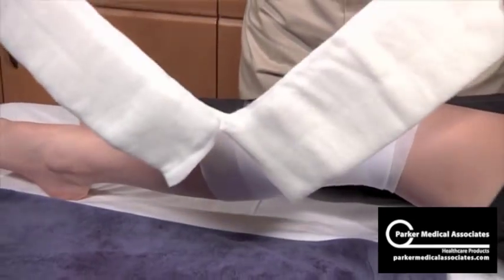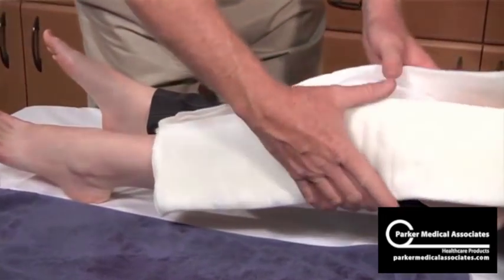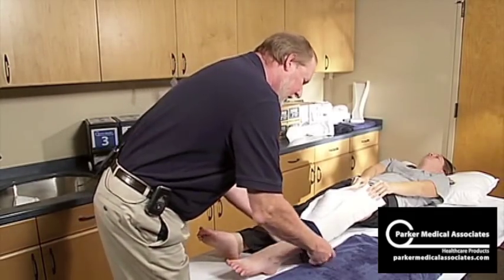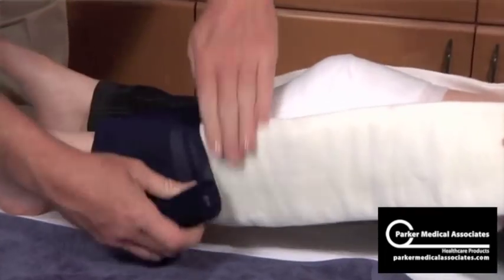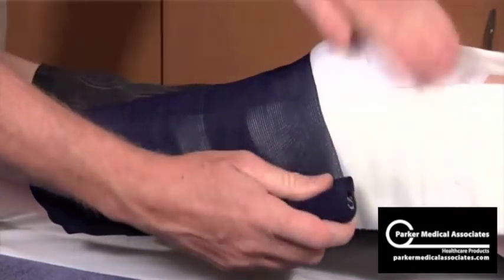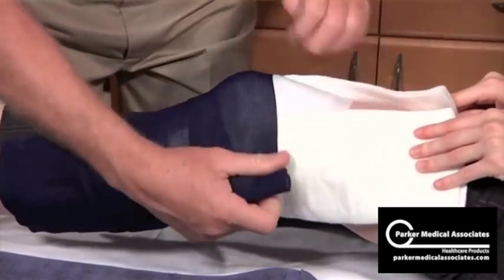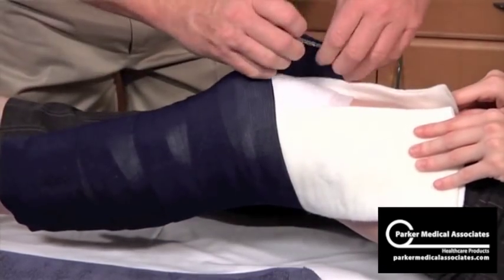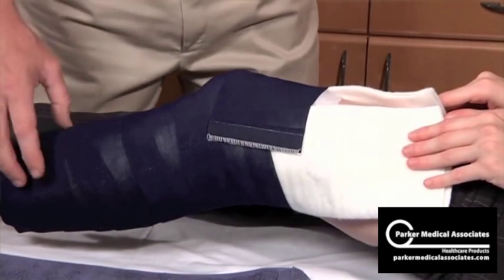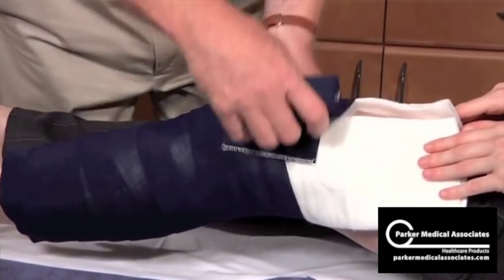Then this tab that you just created — place that on top of the patient's leg anteriorly, and come up medial-laterally, wrapping just to the proximal, coming up medial-laterally. As you notice, there's no pressure on the patella, no pressure behind the popliteal area. You have nice even compression with the bandage wrap, as opposed to having straps where a strap here and a strap here balloons out. This gives you even compression going up the leg.